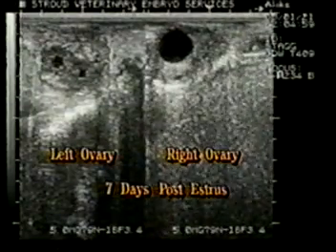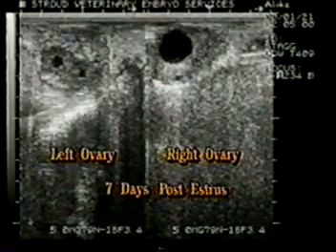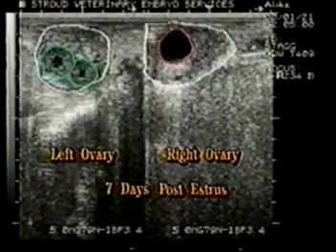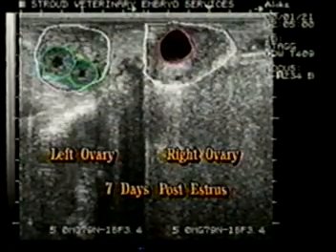This view shows a split screen with both ovaries in view at the same time. This cow is in diestrus. The left ovary has 2 CLs, both fluid-filled. The right ovary has a large 18 millimeter dominant follicle.